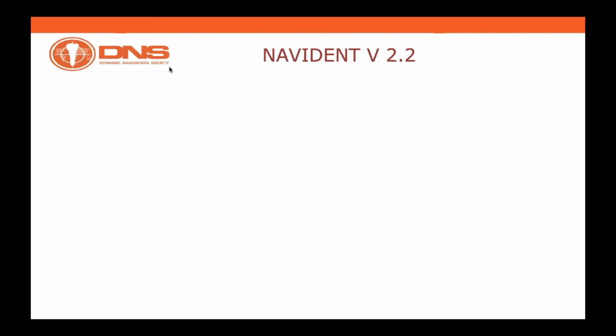It's the new version, which is going to be released by the end of this month, and has so many features and so many benefits, so many that we won't be capable of addressing all of them today.